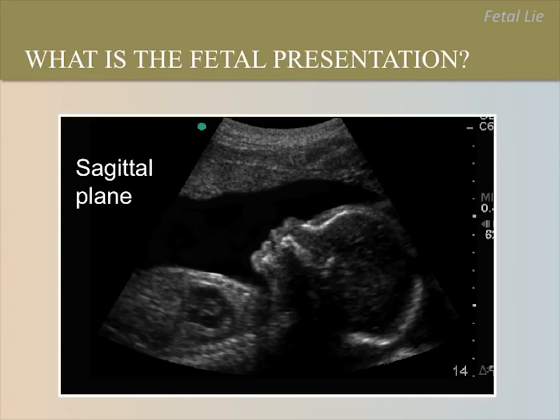This is a sagittal view of the uterus. What is the fetal lie and presentation, and why? Please pause the video now to encourage responses. This is a cephalic presentation and longitudinal lie because the mother's feet are to the right of the image and her head is to the left, so the fetal head is closest to the cervix.